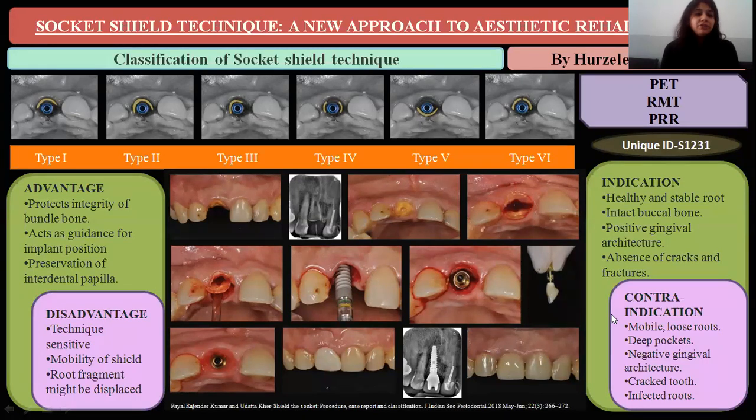There are some advantages of this technique: it protects the integrity of the bundle bone, it acts as a guideline for implant positioning, and it preserves the interdental papillae.